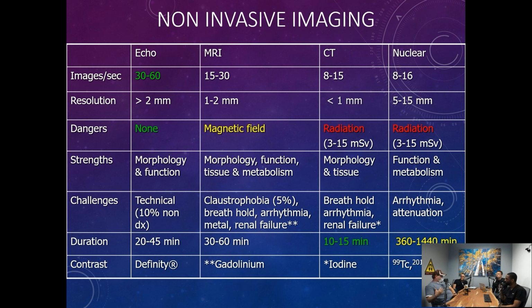You can change the profile by giving somebody contrast, with iodine or barium or what. But at the end of the day, you're just looking at one thing, basically. Whereas with MRI, you can make all these little tweaks and adjustments. And like Francois was saying, really characterize tissue, but it can do so much more.